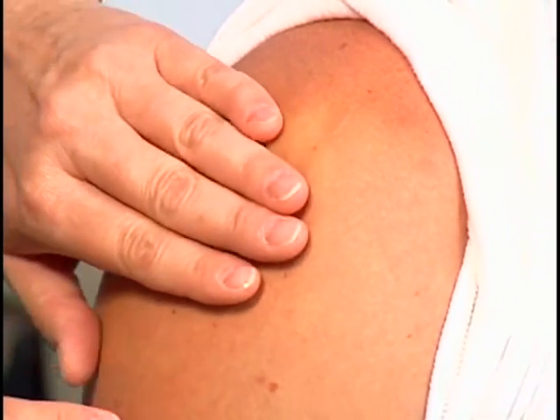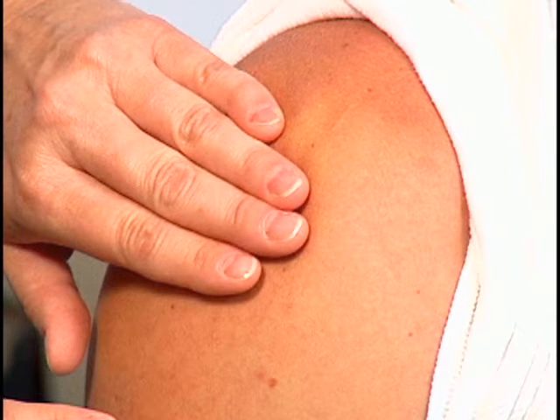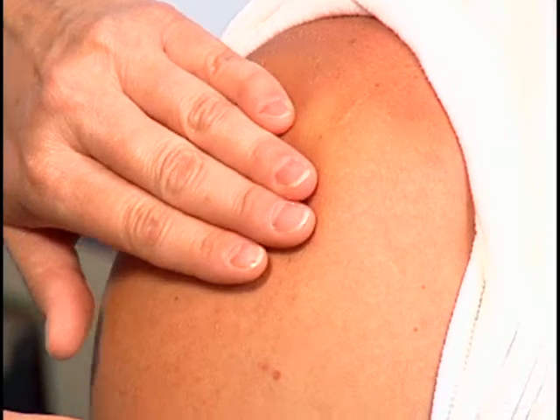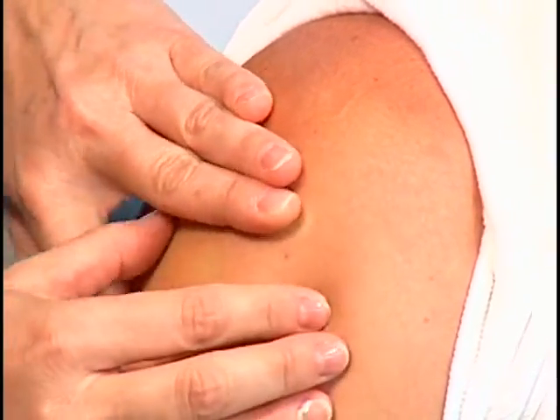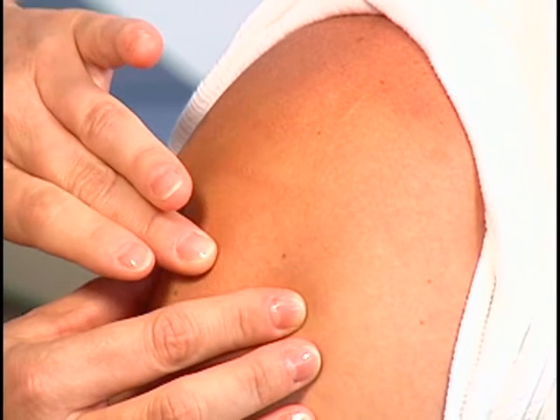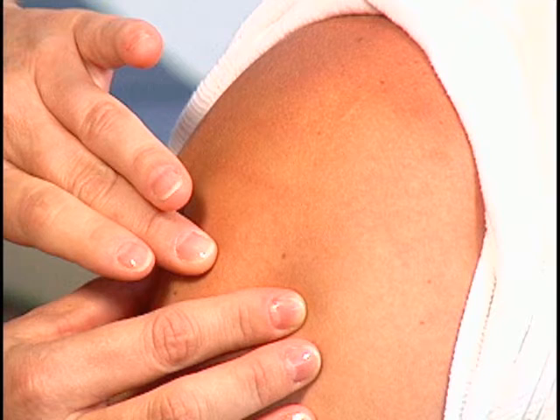Place 4 fingers horizontally across the deltoid muscle with the top finger along the acromion process. The injection site is located 2 to 3 finger widths below the acromion process, which is about 1 to 2 inches below the acromion process. Since this site is small, do not inject more than 1 cc into this site, and do not give repeated injections here. This prevents trauma to the muscle tissue, which could damage it.